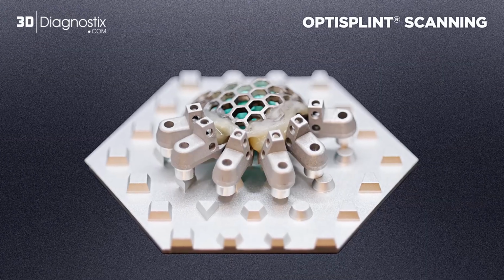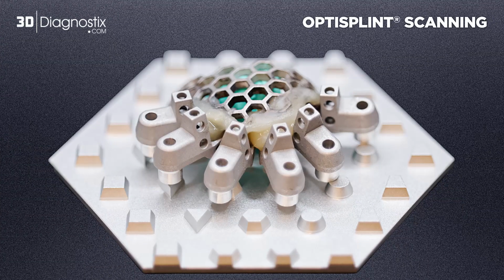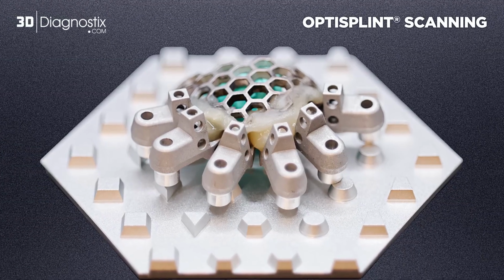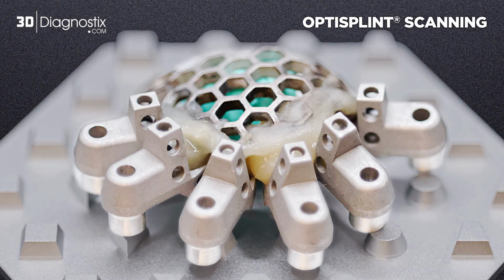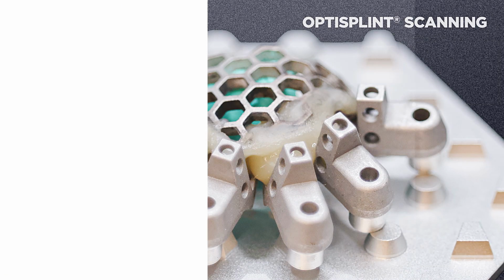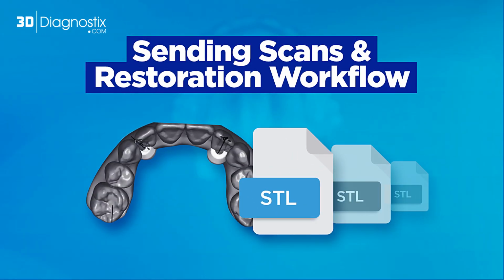For accurate results, we recommend scanning the OPTISPLINT Verification Jig extra-orally using the scan plate. The scan should cover the scan bodies and adequate coverage of the honeycomb frame that connects the scan bodies together. All scans should be submitted to 3DDX in STL format, ensuring they meet quality standards.